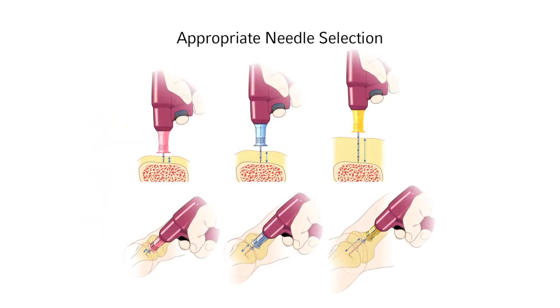Appropriate needle selection is evidenced by the black 5 mm mark visible above the skin when the tip of the needle set is touching the bone prior to drilling.